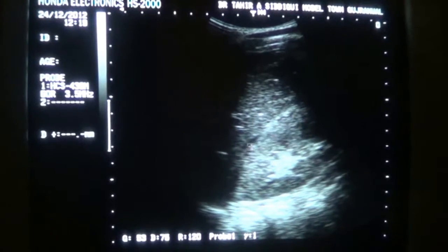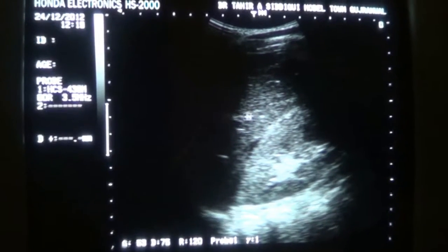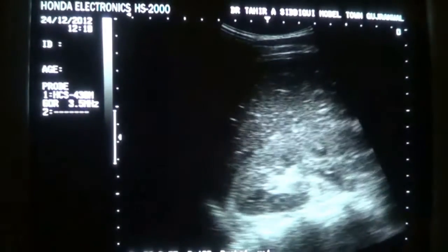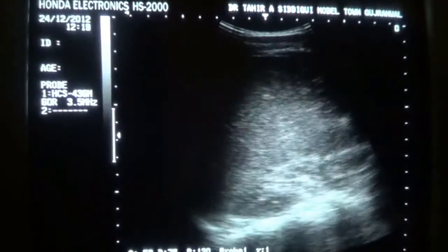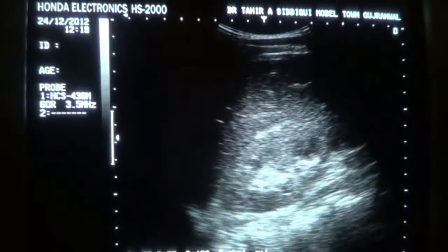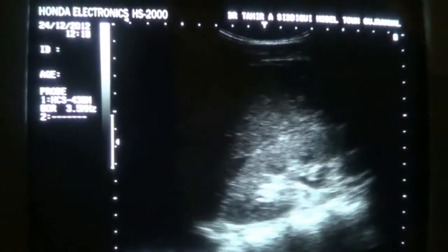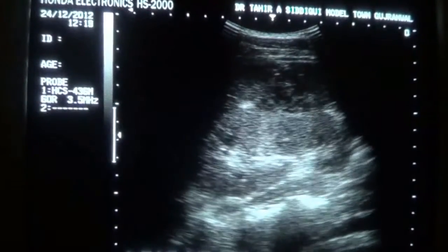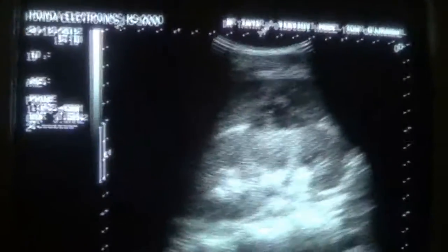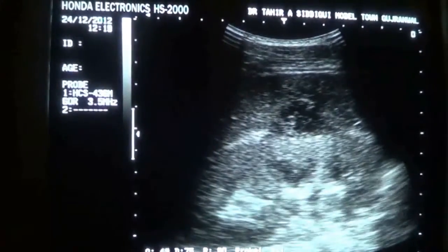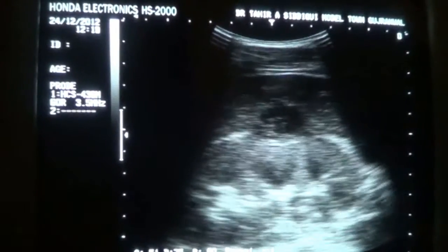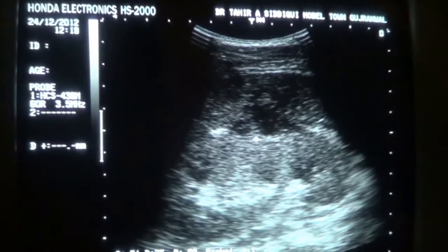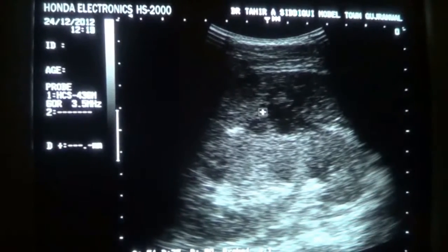This black area is fluid between the liver and the kidney, called the fluid in the hepatorenal angle. Now this patient is shivering while I am performing this ultrasound. You see in this area, the middle region of the kidney. We can see that the capsule of the kidney is elevated.